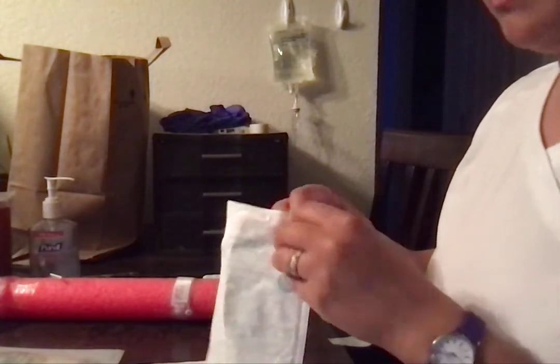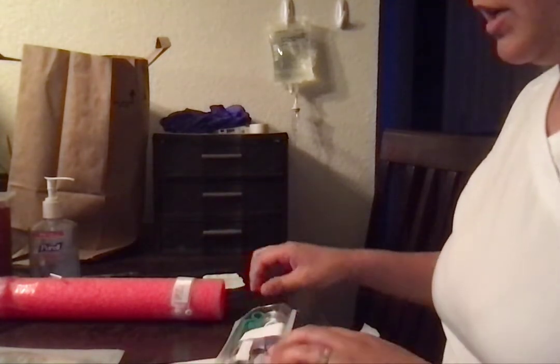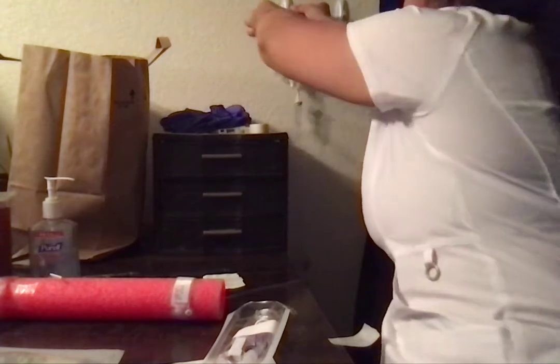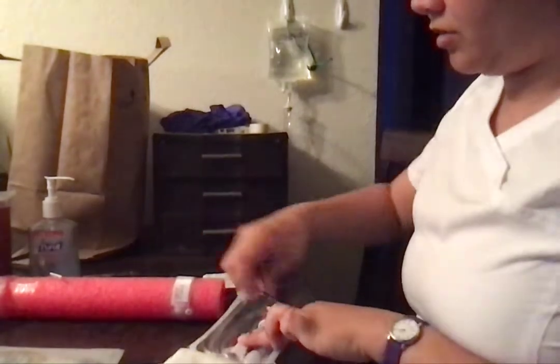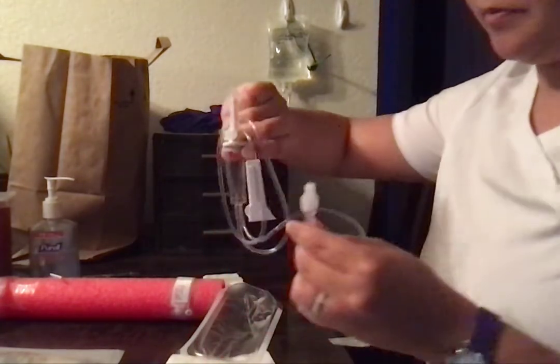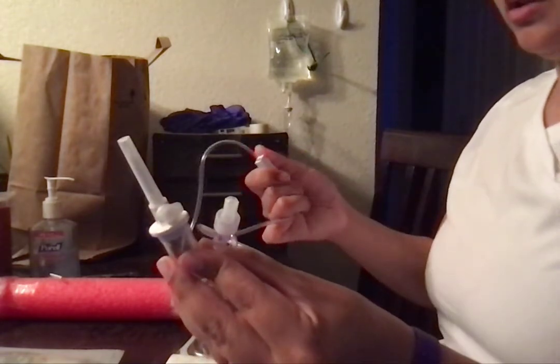Now, aseptically, I'm going to make sure to open this as carefully as possible. When I'm opening it, I'm going to make sure that everything is intact, that the line looks good. Just going to put that there. The caps are still on the ends of both sides of the spike and the IV side, and I'm going to roll it shut.